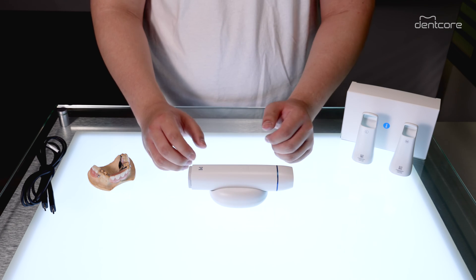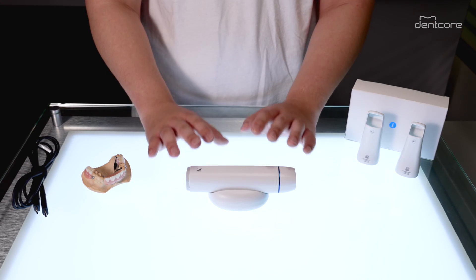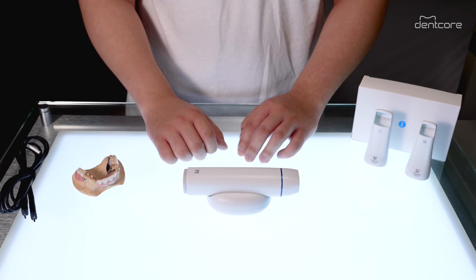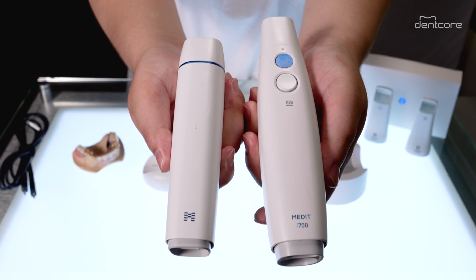For starters, it's tiny — look how small it is. It's one of the smallest and most lightweight scanners on the market right now at only 165 grams. This makes it almost 100 grams lighter than the i700 and less than half the weight of many other intraoral scanners. You can see the size comparison right here with its predecessor.